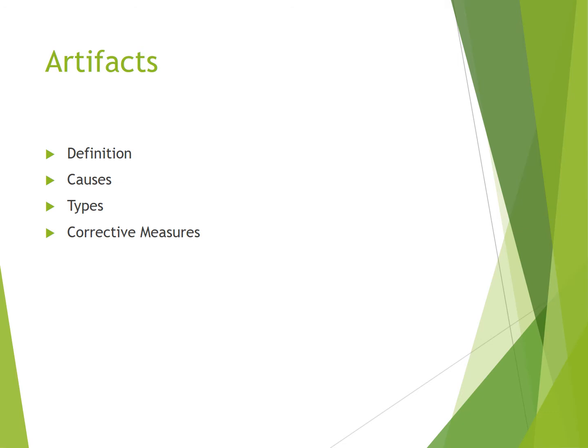While we are studying artifacts through the next few lectures, make sure to record what causes them, what assumptions are being violated by the ultrasound machine, what hindrance they put onto our pictures, or possibly what helps them, and then also how we can correct it. Those are going to be the main things that you're going to want to know for each artifact.